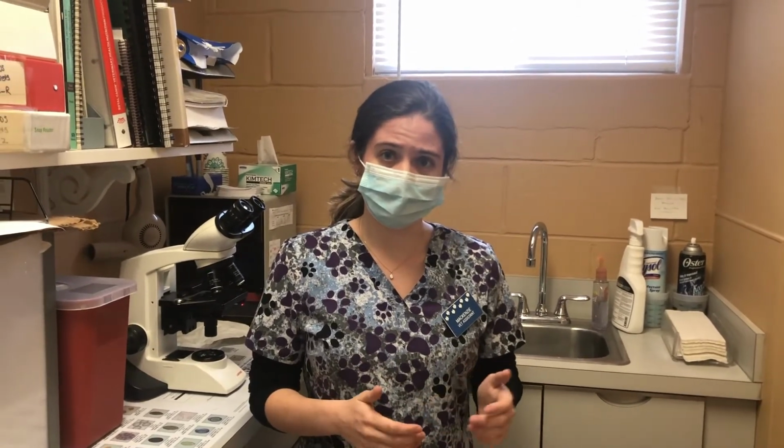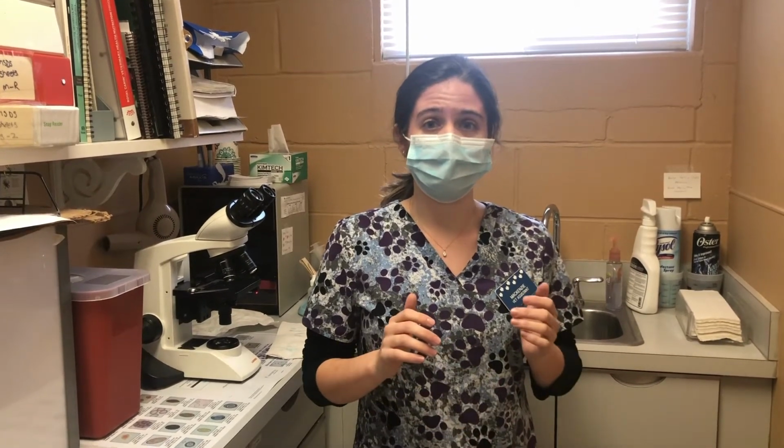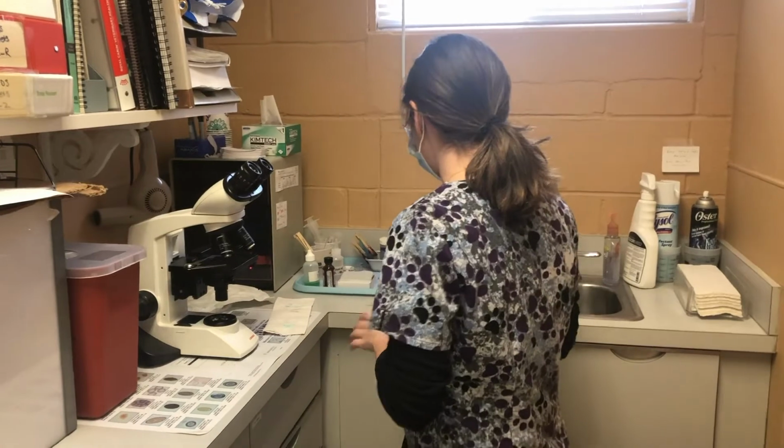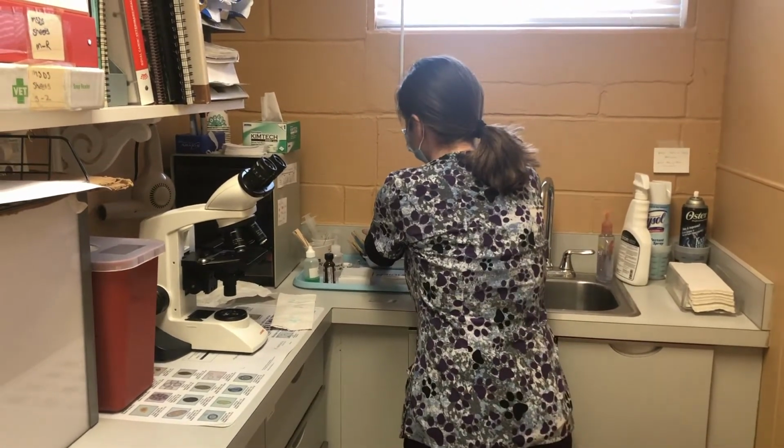Lastly, we have our metestrus. In metestrus, you're going to see a little bit of decrease of swelling of the vulva, and there's not going to be as much discharge. And under the microscope, you're going to see that all of your cornified squamous epithelial cells are going to become non-cornified, and they're all going to revert back to what they were in anestrus. So now that we've gone over our four stages, I'm going to stain our slide.